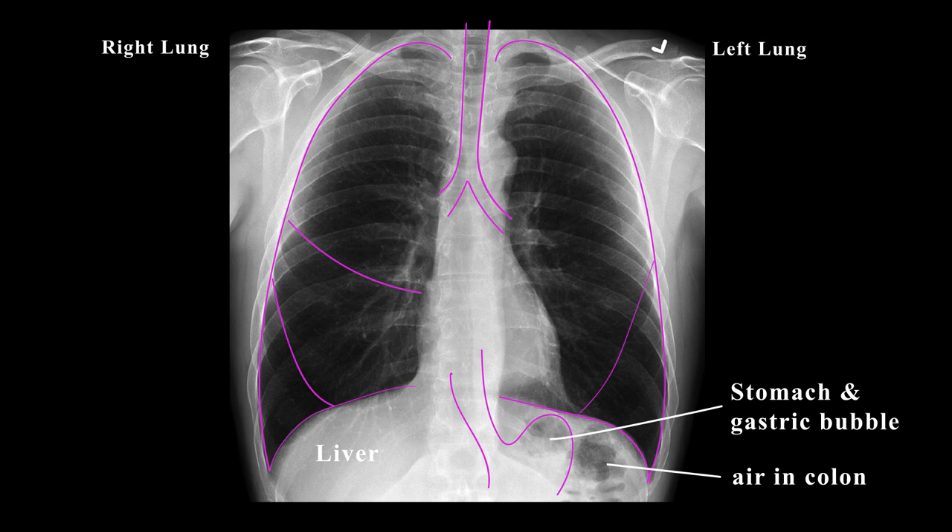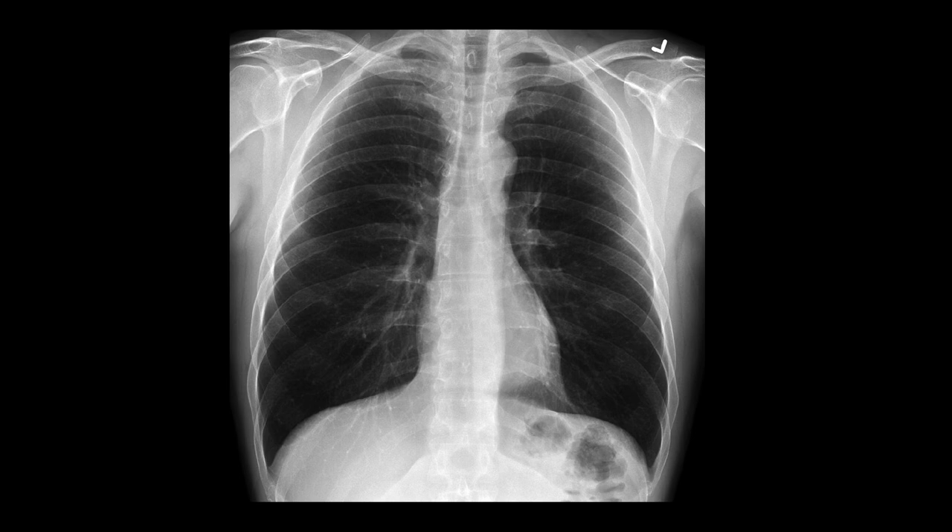If you look closely in the lung fields, they're not completely black. You will see fine strands of white in them all the way to the edges of the lungs. These are the pulmonary vascular markings and will come in handy later when looking for things like pneumothoraces or a collapsed lung.